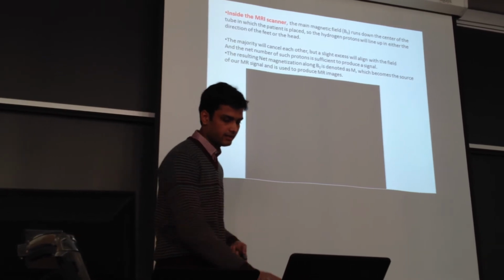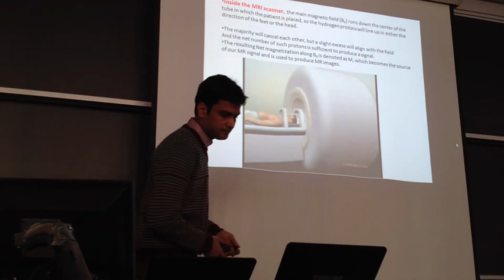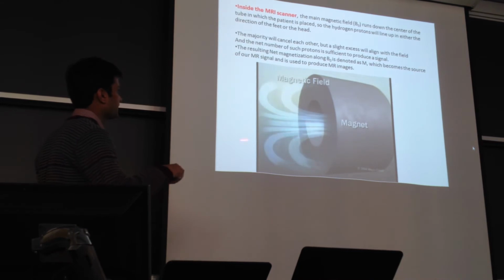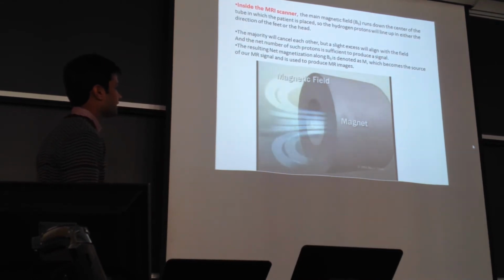So what I just said we can understand through a small video. So this is the direction of the magnetic field in the horizontal direction.